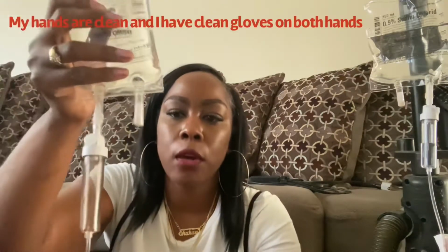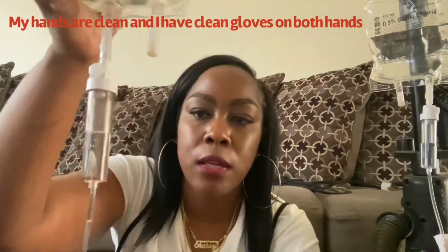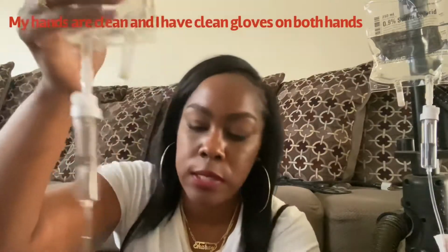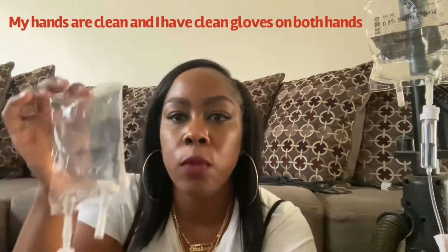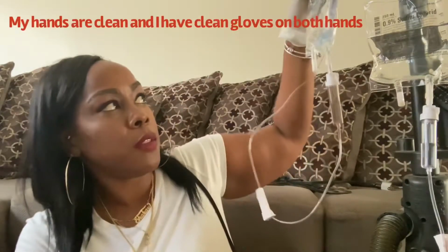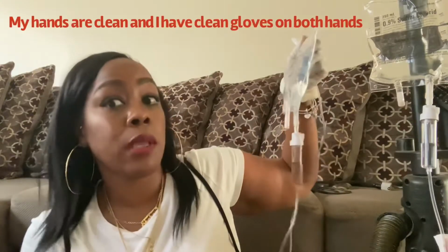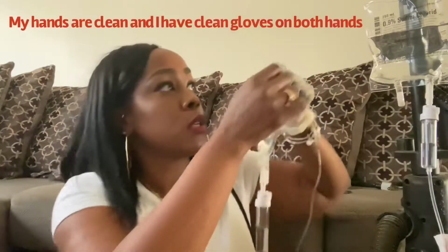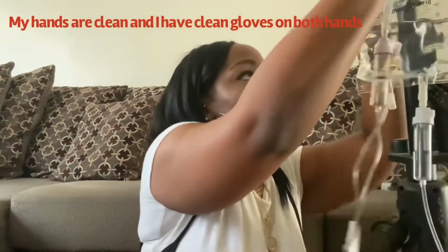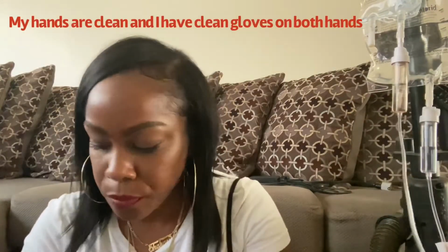I'm going to flip it back over again, squeeze about right here, because of course you want to see the drip coming down. You want to be able to see it. If it's all the way up there, of course you can't see it. Usually when you have this, you hang this above the other fluid, the normal saline, but I don't have a higher place to hang it, so that's the only reason why I'm not. But of course I know that you're supposed to. Hopefully it will fit right here. Okay, I did my best. So it's hanging right there.